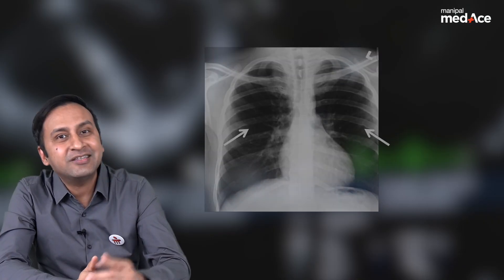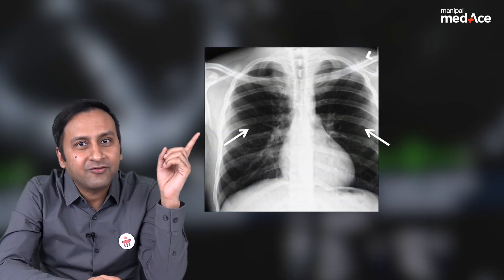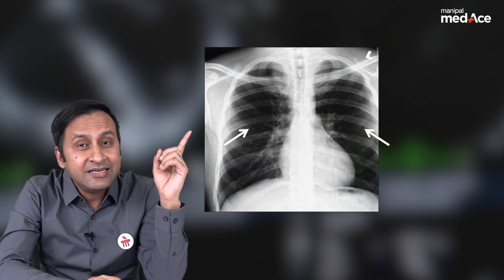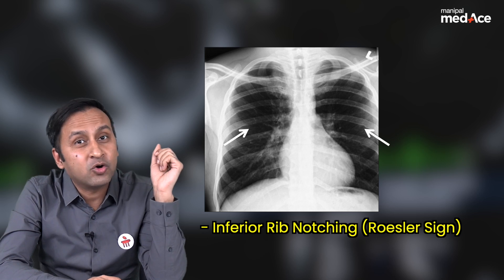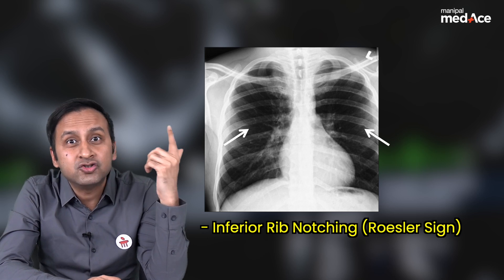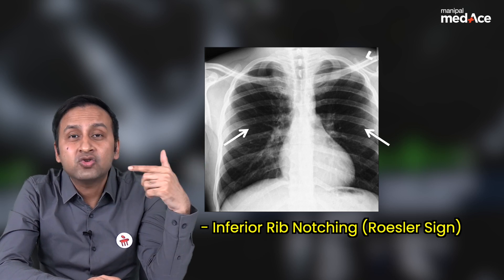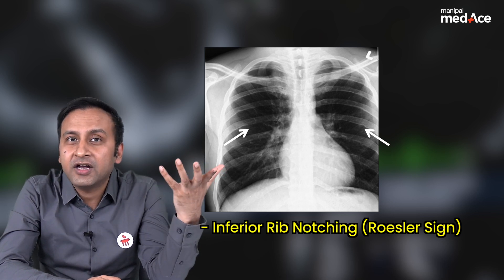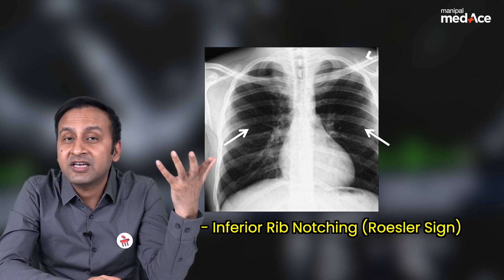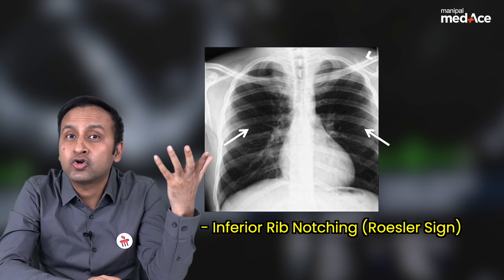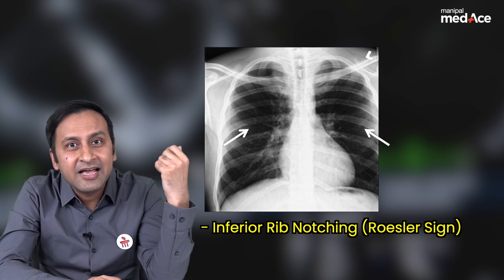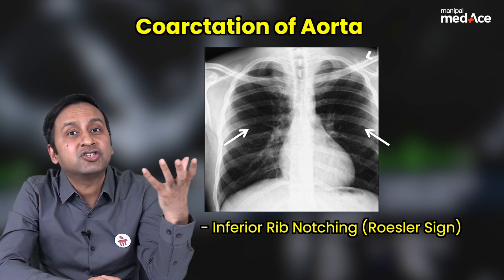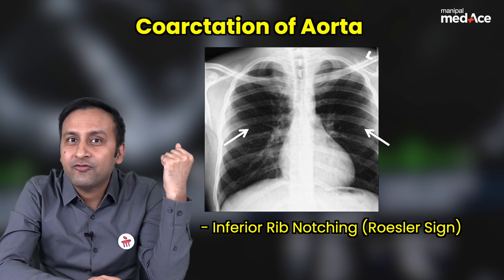Coming on to our last case, look at this chest radiograph. You can see that the under surface, or inferior surface, of ribs on either side is notched. This notching of the under surface of the ribs is called the Roesler sign, and we get it in patients with coarctation of aorta.